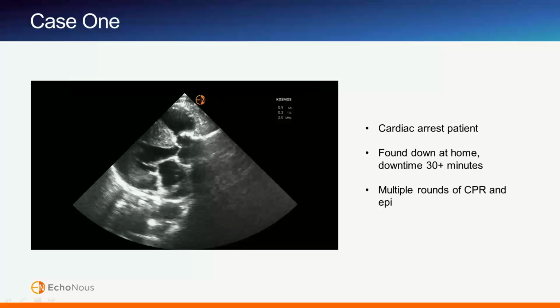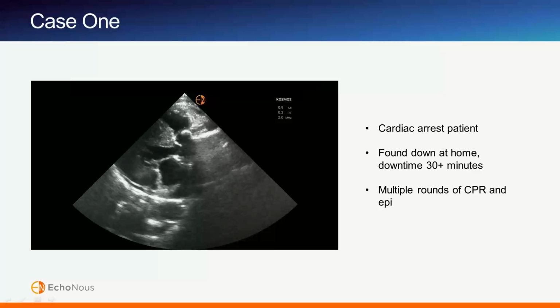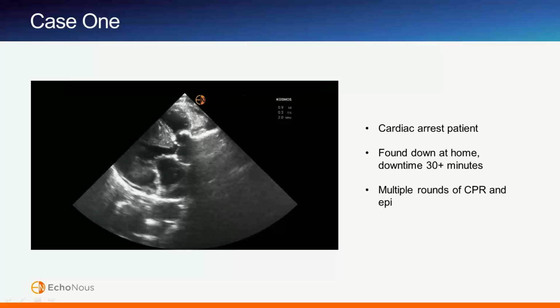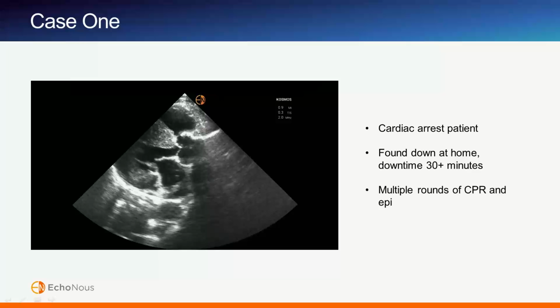I think it gets really tricky when you still see some cardiac activity, which is very poorly defined in the ultrasound literature. I don't know how you are defining cardiac activity in this. When you're watching this ultrasound clip, are you thinking that this is coordinated, or how are you defining whether or not this is good or not? That's a great question, and I think when I look at this ultrasound, I definitely see that there is some coordinated activity.